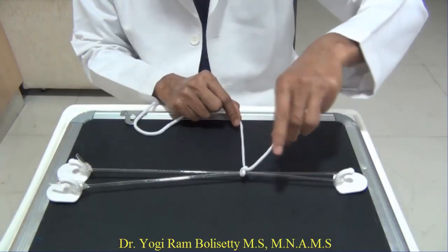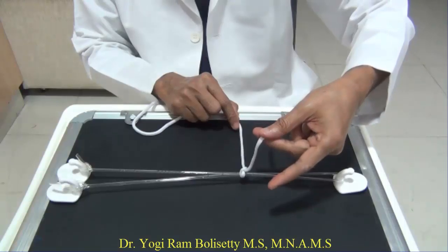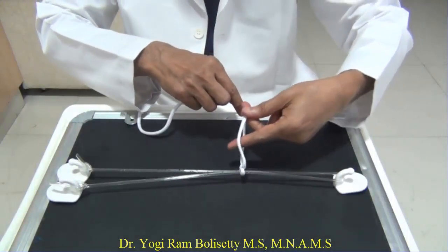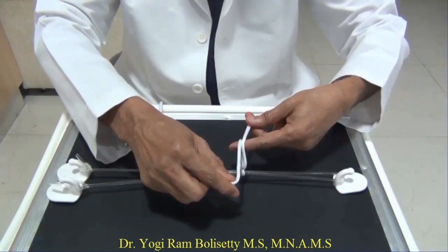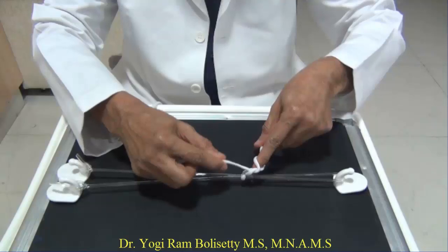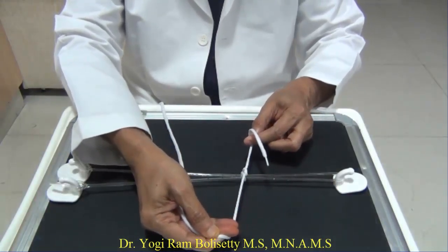For additional security, you can make a third throw. The third throw should be just like the first throw. Now the short strand is between the middle finger and the thumb. Get the index finger under the short strand, cross the long strand over the index finger, and now flex the index finger, hooking the long strand, straighten the index finger, pronate your hand, get the thumb near to it, and pull the two strands in 180 degrees.